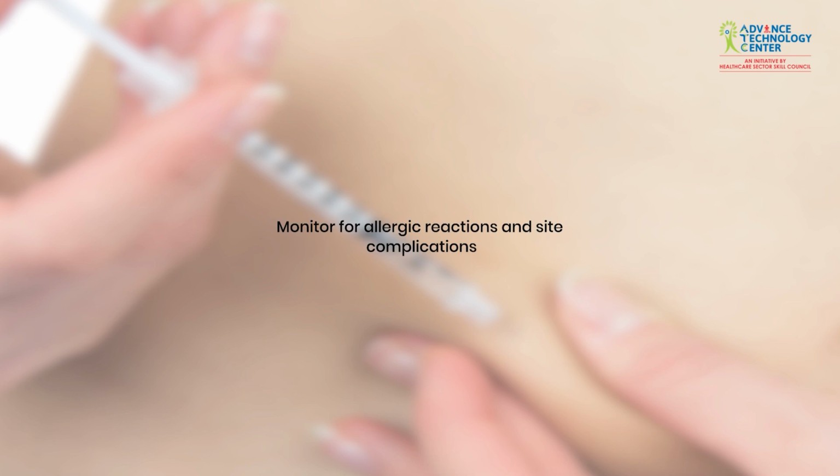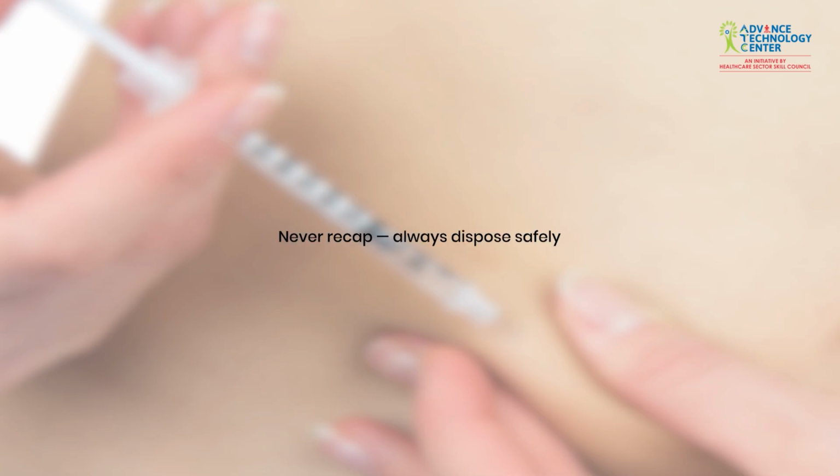Monitor the patient for allergic reactions and check the site for redness, swelling, pain, bleeding, or infection. Never recap a used needle. Dispose of it immediately in a sharps container to prevent needle stick injury.